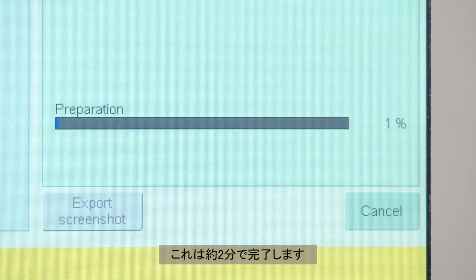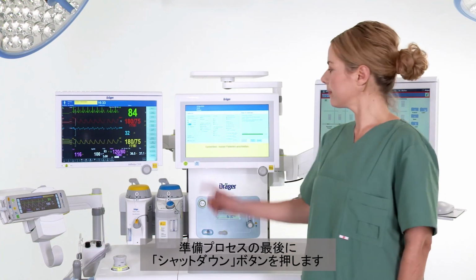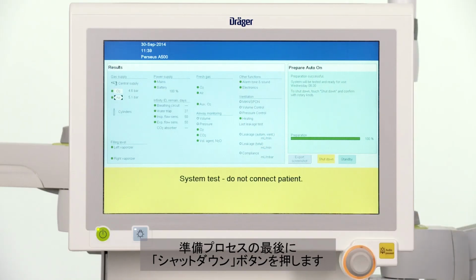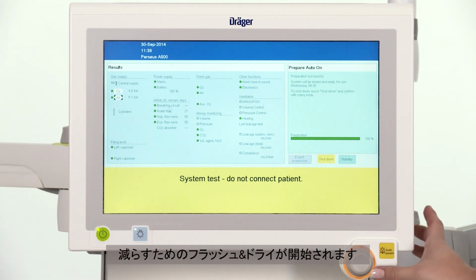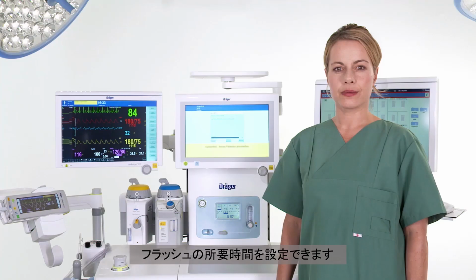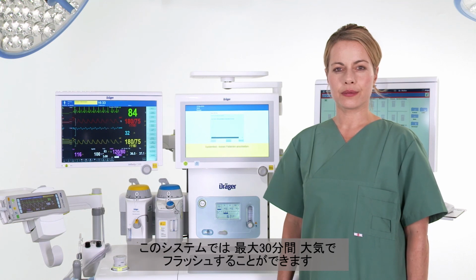This is completed in about 2 minutes. At the end of the preparation process, press the Shut Down button. The device will now start the flushing process to reduce residual anesthetic agent and moisture in the system. You can configure the duration of the flushing process. The system can be flushed with ambient air for up to 30 minutes.